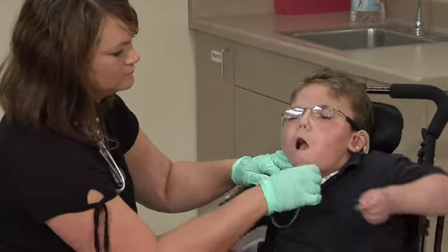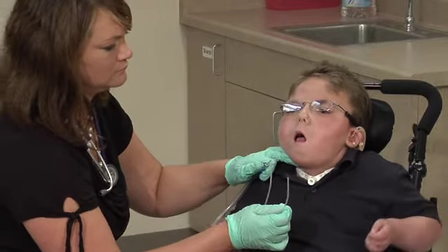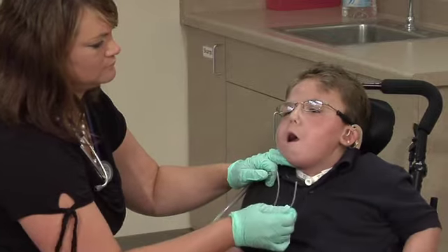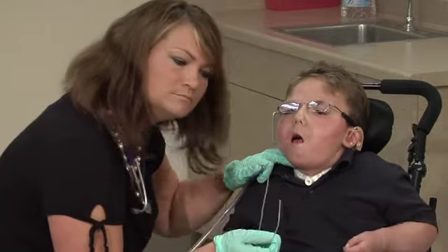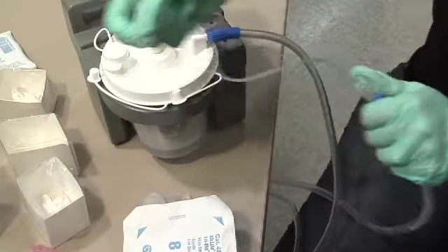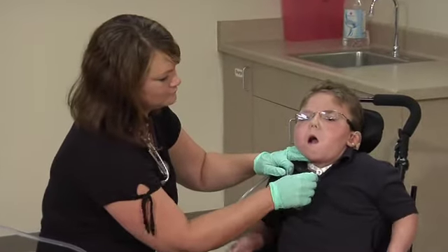Twirl the catheter between your fingers as it is pulled out of the tracheostomy tube. Remember, when the suction catheter is inserted into the tracheostomy tube, the student's airway is occluded. Total suction time should not exceed 5 seconds. After removing the suction catheter, suction a small amount of sterile saline to clear away any residual debris or secretions.